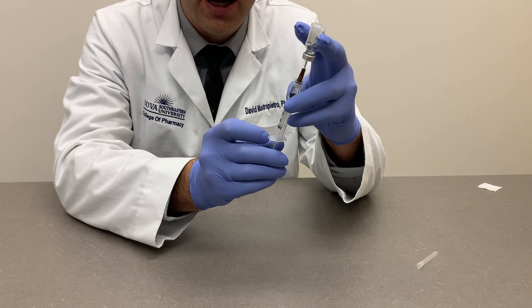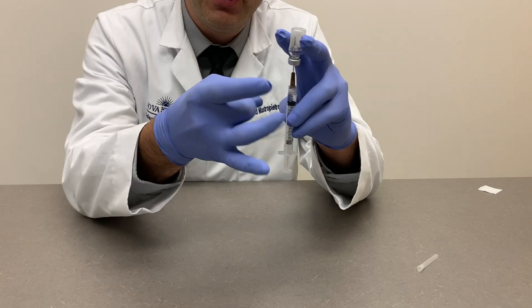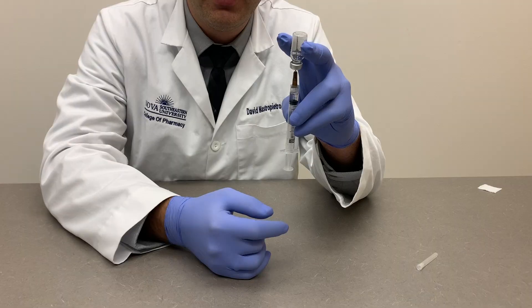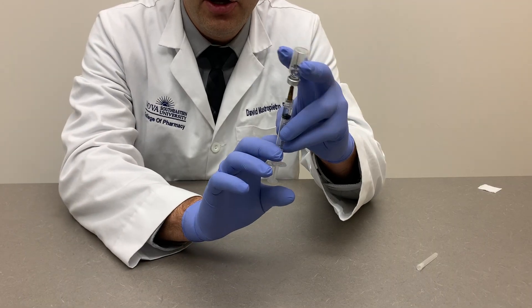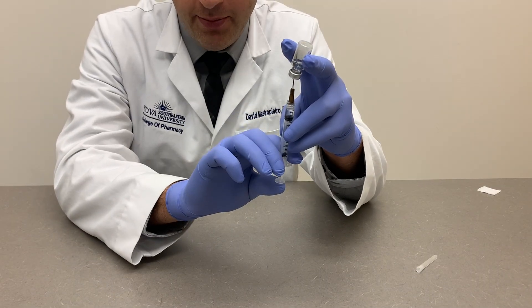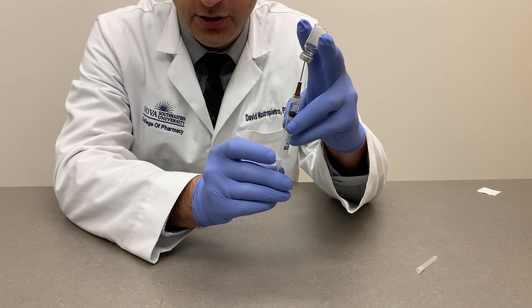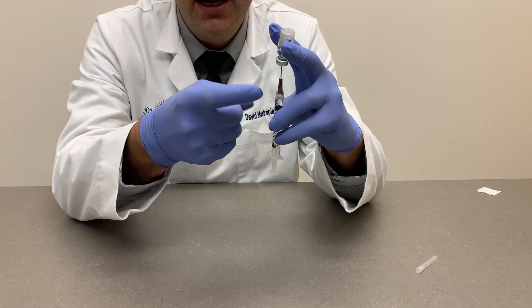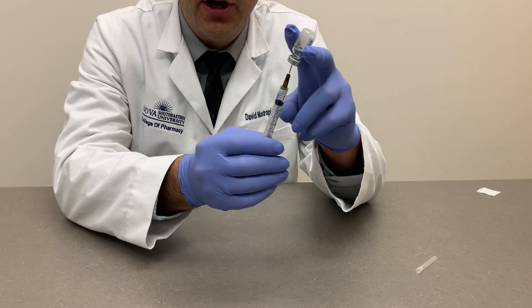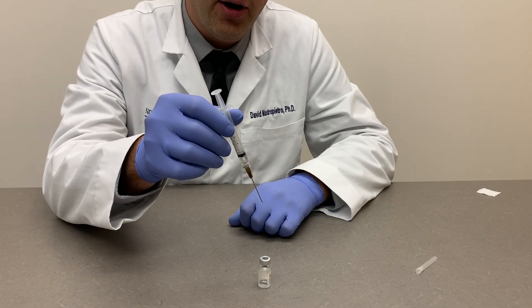If you wanted 0.5 mL and there's a small bubble, simply tap the side of the syringe and the bubbles will loosen and rise to the top. Don't hold the syringe sideways when doing this or the bubbles won't rise. Once the bubbles are at the top, push up to expel them, then pull back on the syringe to exchange air for fluid so you have all liquid in your syringe for the required dose. Once your dose is ready, set it back on the surface and slowly remove the needle from the vial.